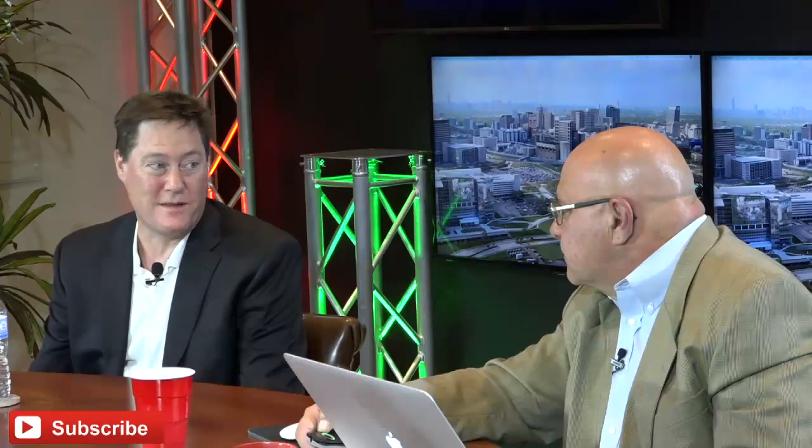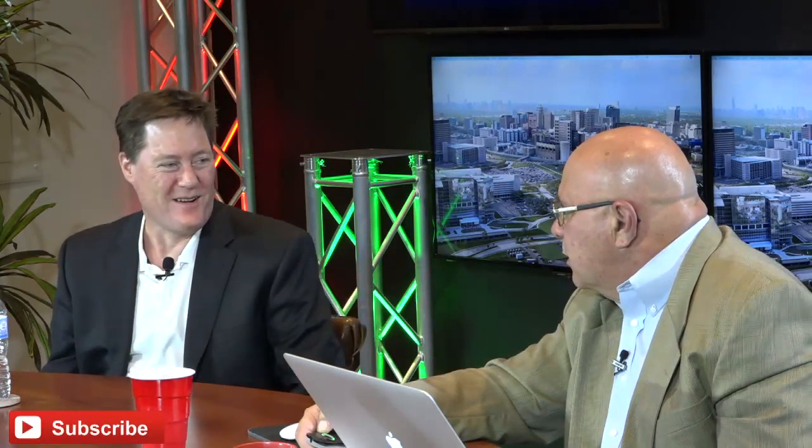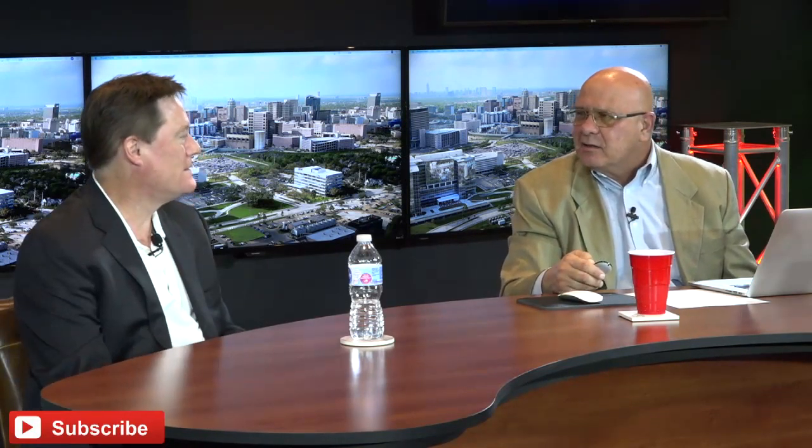You know, if you could do that on an ECMO circuit, you could potentially do that on a heart-lung bypass circuit. Which would be scary. Would be incredible, wouldn't it? No, it'd be cool. But think about the benefit of that. Sure. Well, but not on the heart-lung machine. ECMO, maybe. Not really on the heart-lung machine, because you have to be concerned about blood that becomes static, that's not flowing. Yeah, in the heart and everything else, and the coronaries. And so I think that'd be problematic to do that.